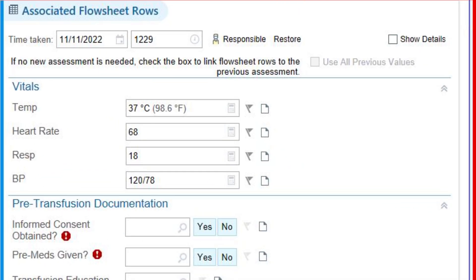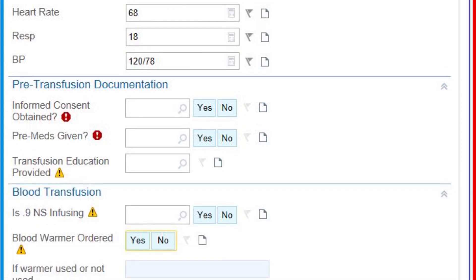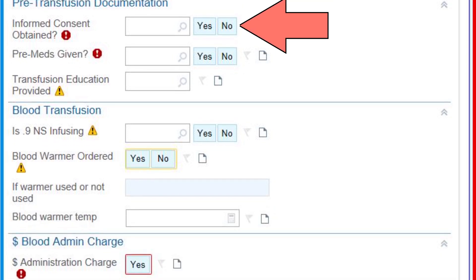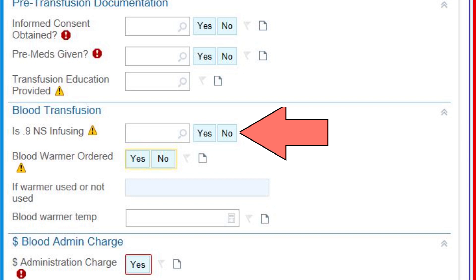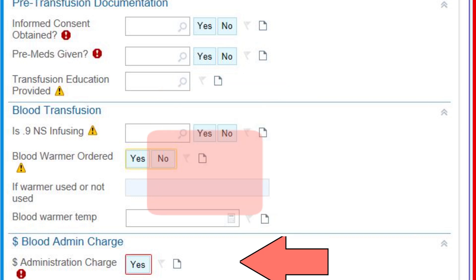If pre-vitals were charted within the last 30 minutes, they should auto-populate in the vitals field. If they do not populate, enter them here. Scroll down to address some more required fields: verify that consent was signed, that any pre-medications were administered if ordered, that patient education was provided, and that normal saline is infusing — remember, 0.9 normal saline is the only solution appropriate for use with a blood transfusion. Identify if a blood warmer was used. And finally, choose Yes on administration charges to complete this sheet.